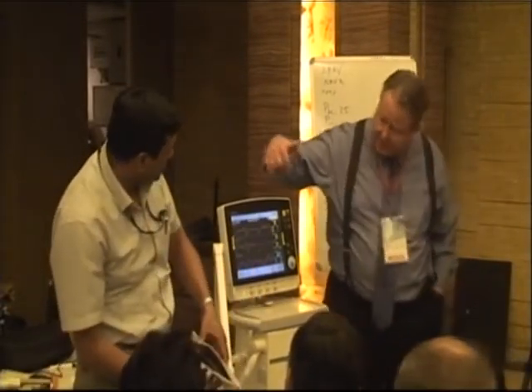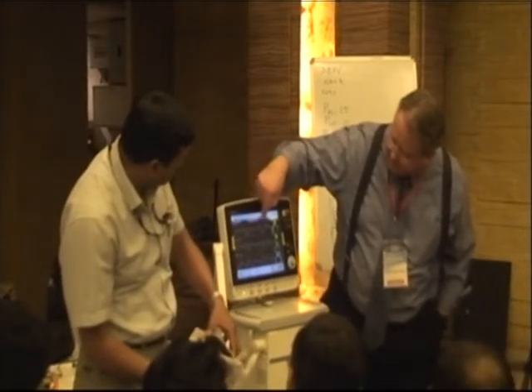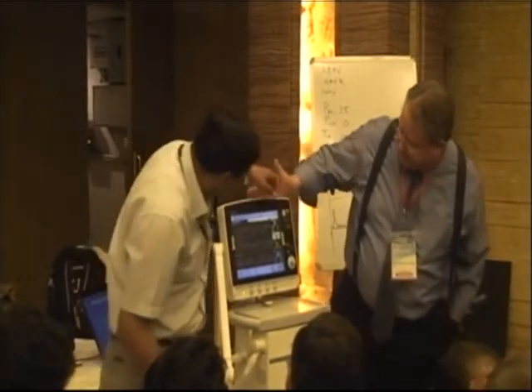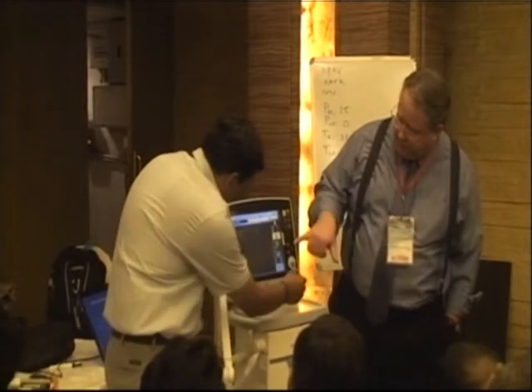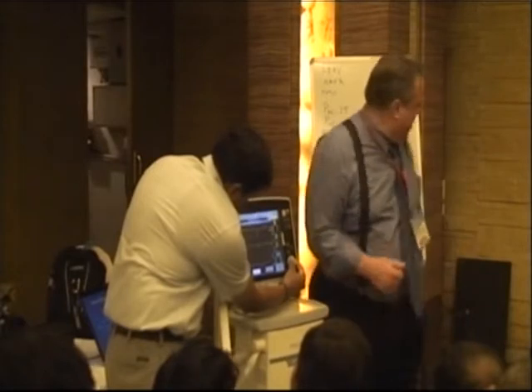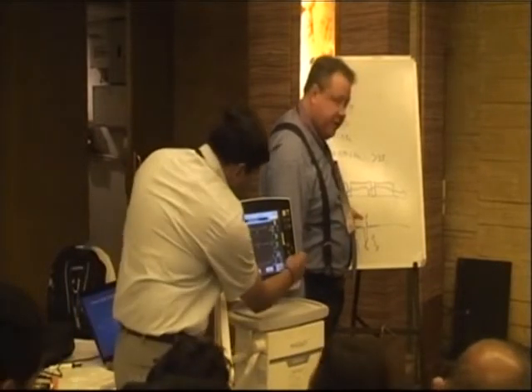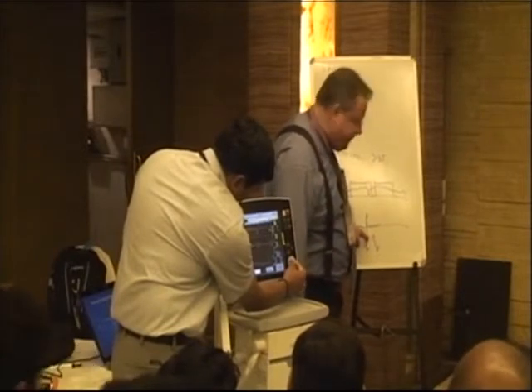So when we look at this, we have breathing spontaneously, we release, and we go back to breathing spontaneously. This waveform has to do with inhalation, exhalation, and flow. What we're looking at on this bottom screen specifically is exhalation. This is inhalation. We go up to the high peak, and then we breathe spontaneously. That's the flow. And when we drop down for exhalation, the flow comes back only about 50% to baseline.